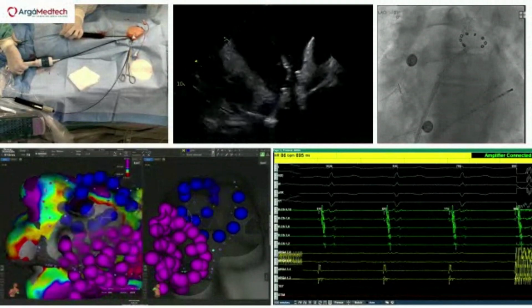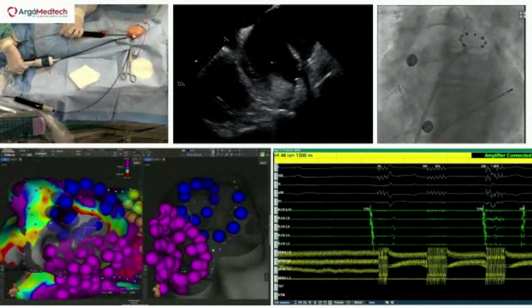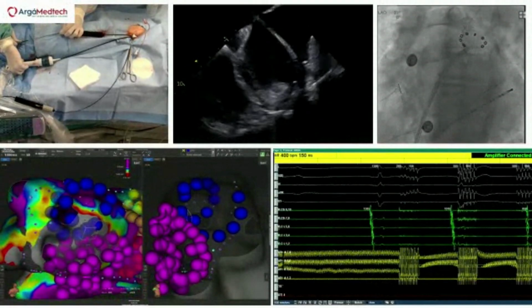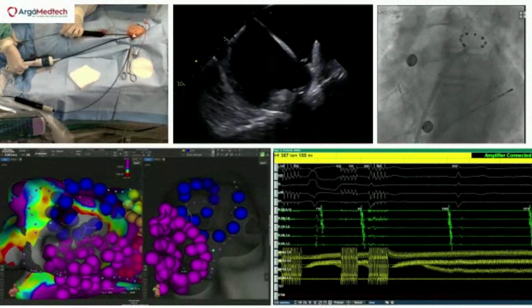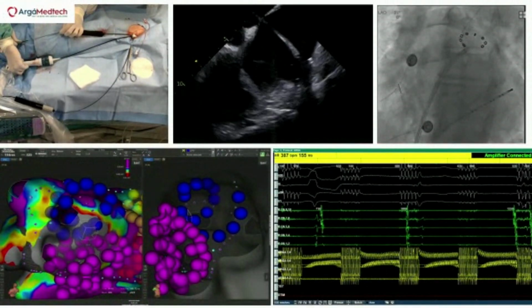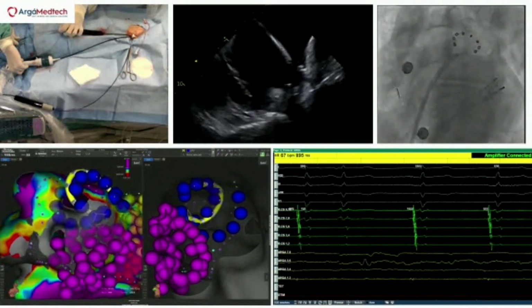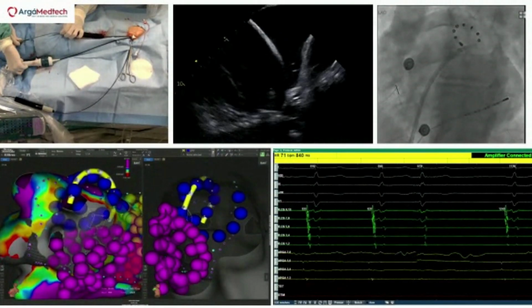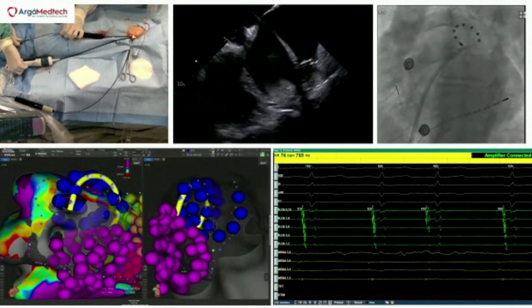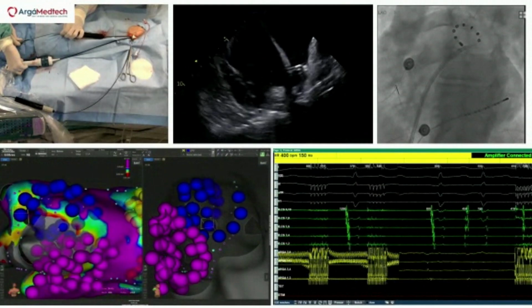You nicely see on ICE that we are just at the ostial. How do you judge proximity? Proximity of what? To the tissue, proximity with the catheter. So currently we can visualize only impedance-based proximity and operate here. Sorry, this is posterior, superior, anterior for the left superior. Go, pulse 3.